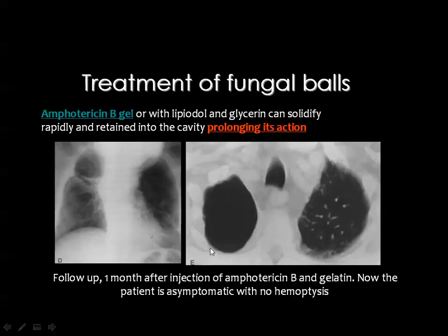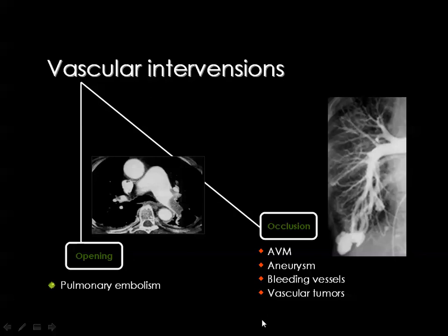Here you can see the cavity which is free of fungus after death of the fungus itself upon multiple injections of amphotericin B, and this drug may be mixed with gel or lipiodol in order to prolong its effect inside the cavity on the fungus itself.